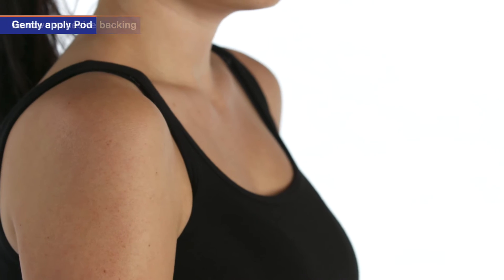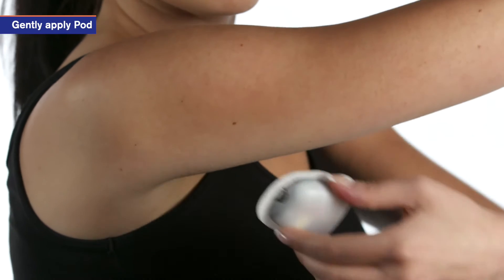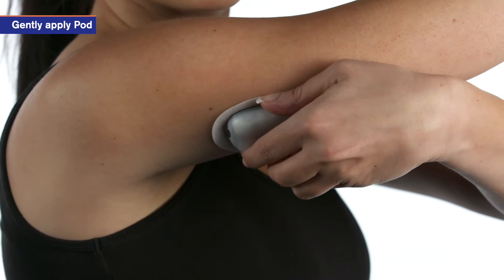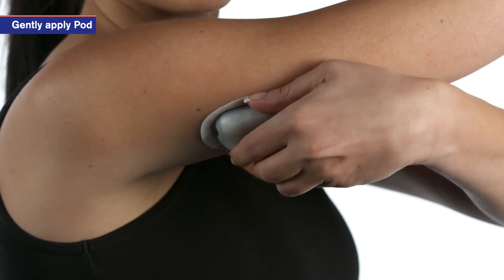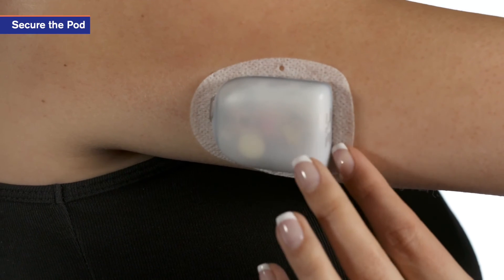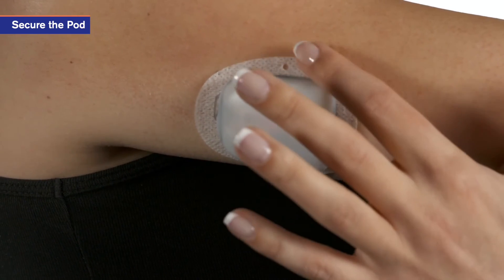Gently apply the pod to the selected infusion site in the proper position. Try to place it flat and even on the skin to avoid any wrinkles in the adhesive. Once the pod is applied, run your finger around the edge of the adhesive to secure it in place.